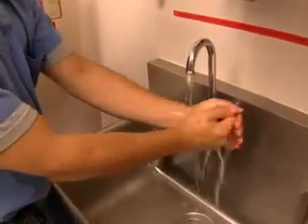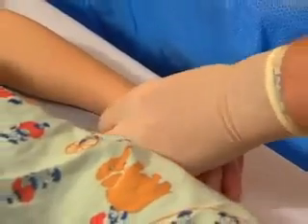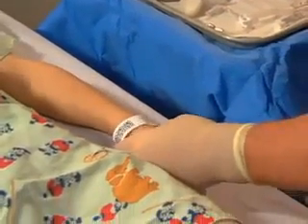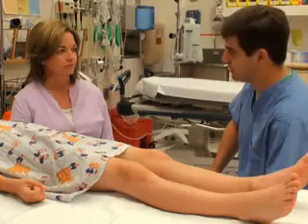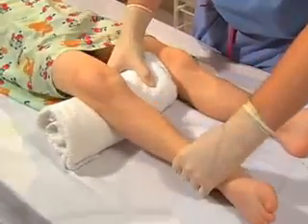Follow standard precautions. Wash your hands prior to any contact with the patient. Whenever possible, identify the patient using 2 identifiers, such as name and date of birth, before beginning the procedure and whenever a procedural timeout is initiated. Explain the procedure to the conscious patient and to any family members who are present. Position the patient so that the selected insertion site is easily accessible.